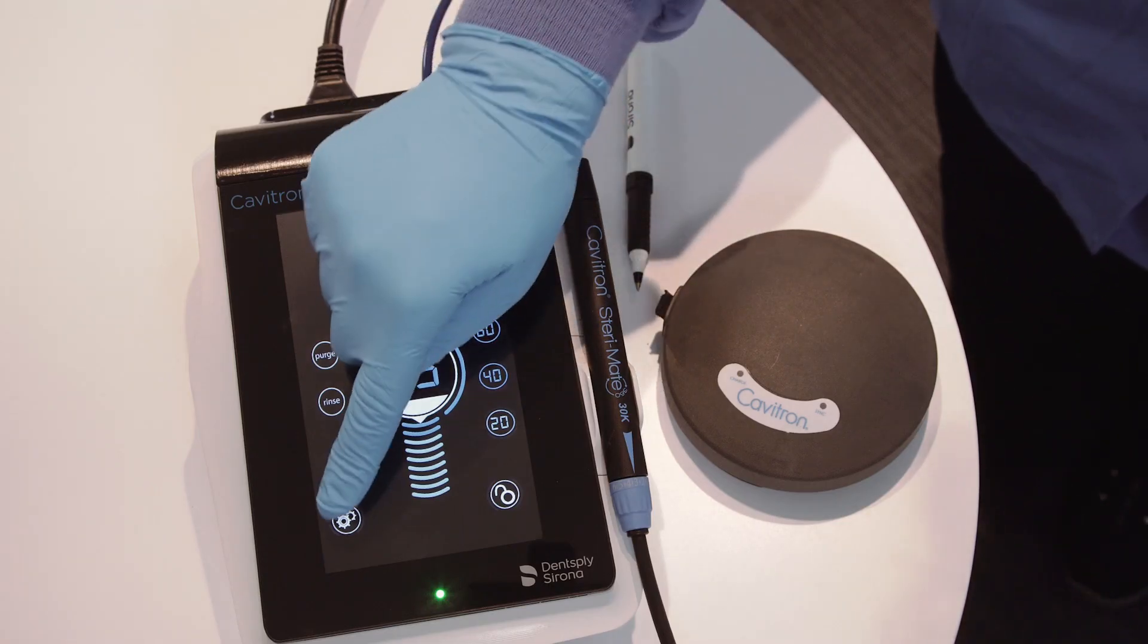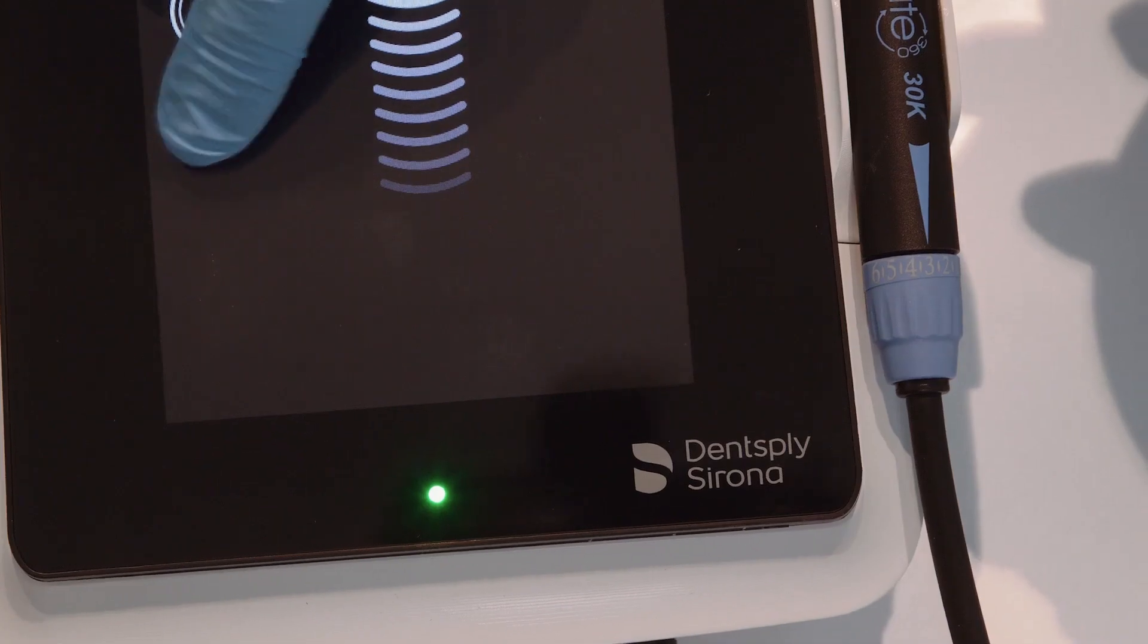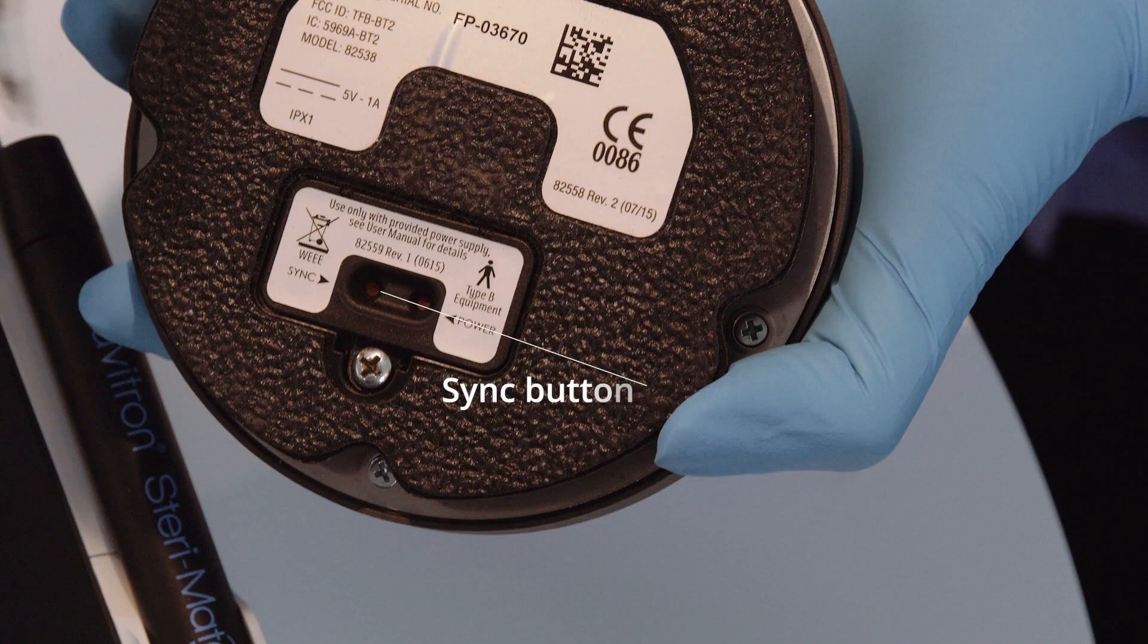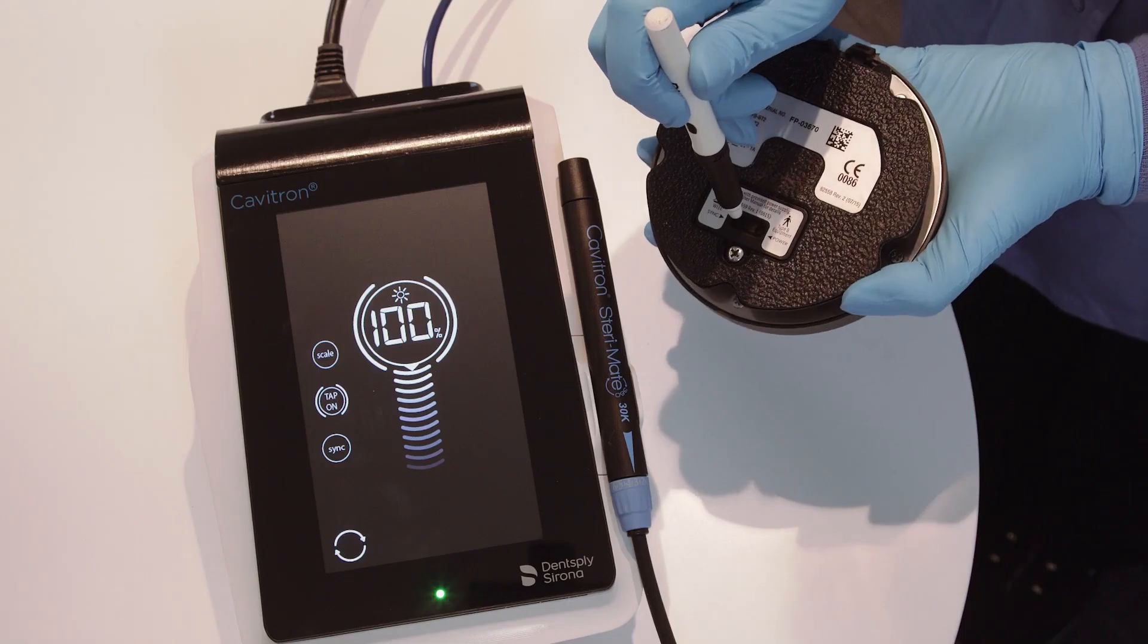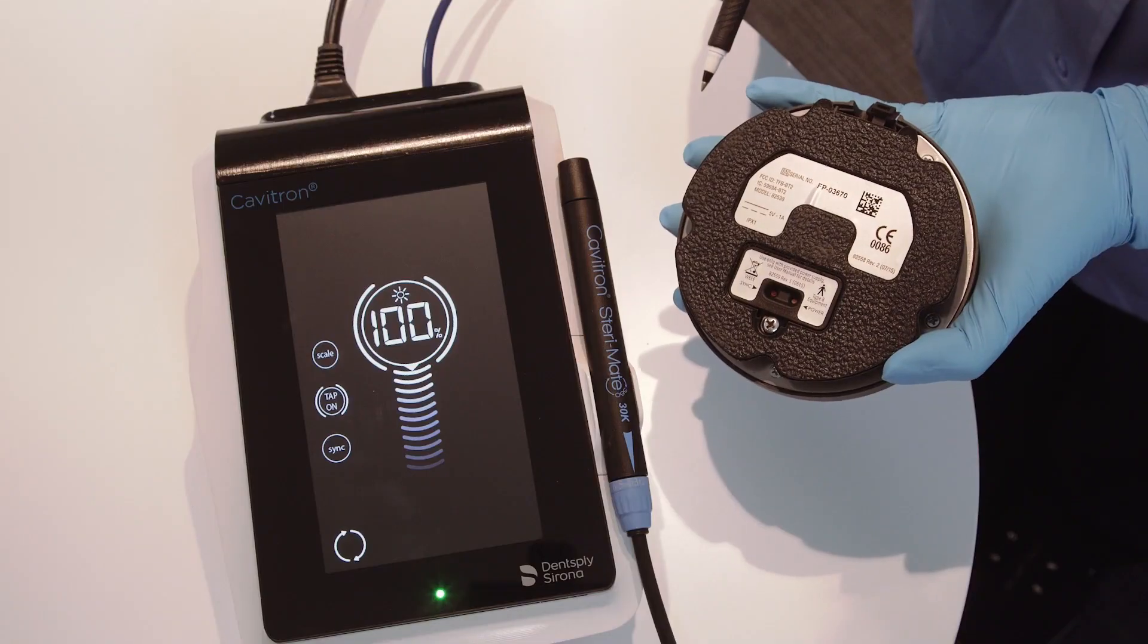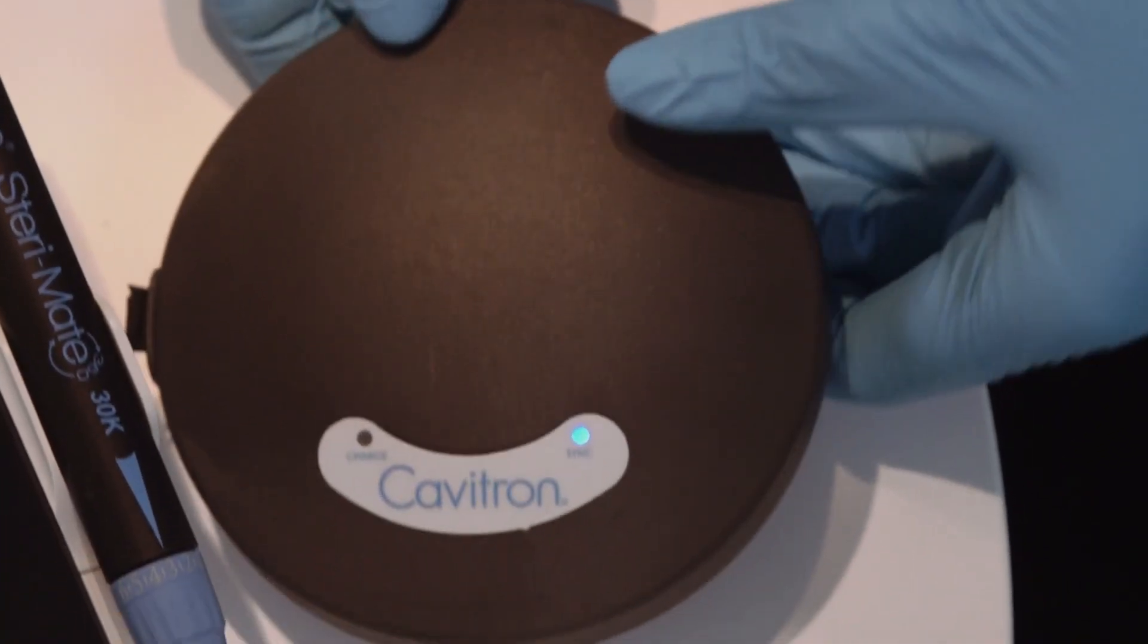Next, press and hold the settings icon until the settings screen appears. Tap the sync icon on the settings screen, followed by pressing the red sync button on the bottom of the foot pedal and hold for at least three seconds. Synchronizing is complete once the sync icon has stopped rotating and sound indication occurs.